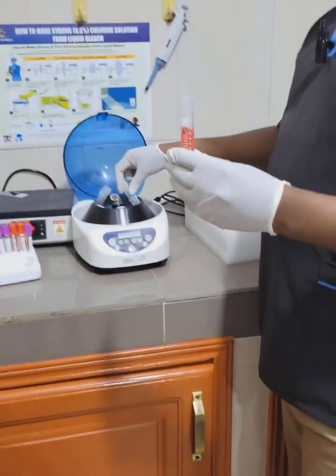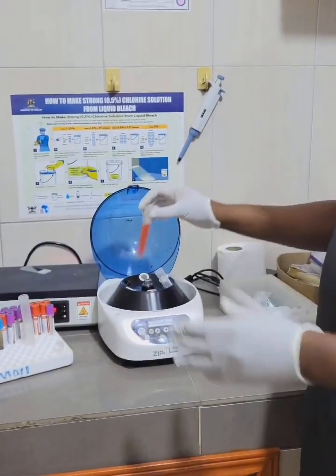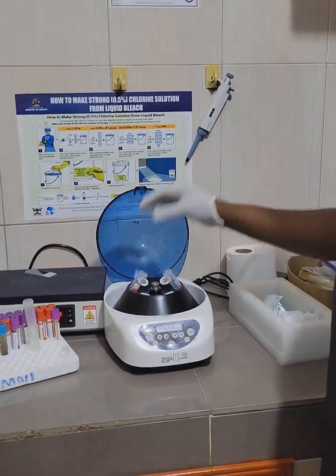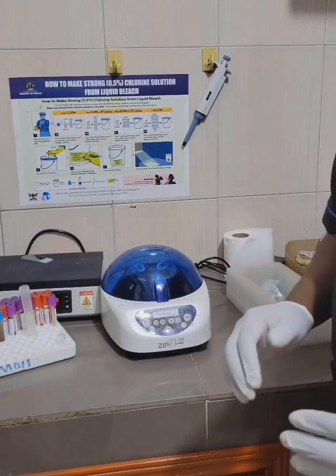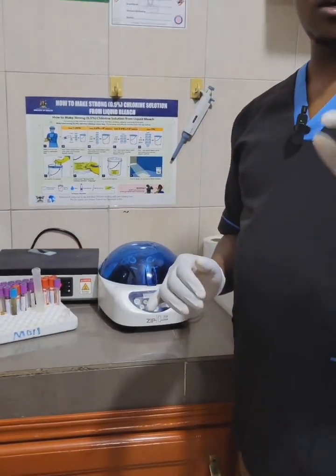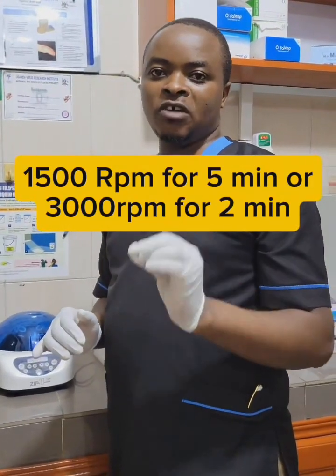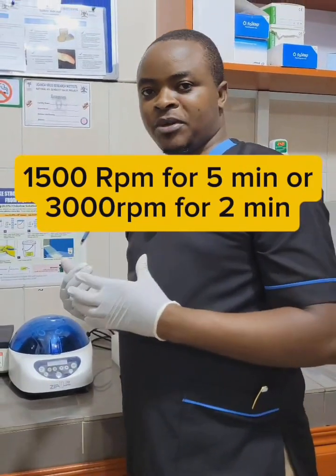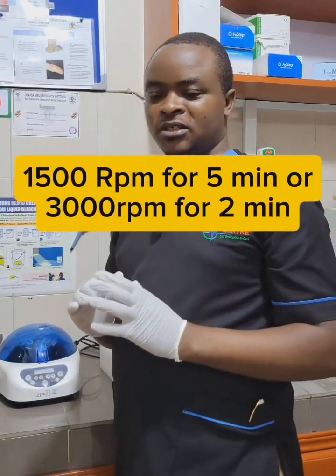You load both the urine sample together with the tube you're using for balancing into the centrifuge. Then afterwards, close the centrifuge and set the centrifugation speed. The one preferred, we can use 1500 RPM for 5 minutes, or we can use 3000 RPM for 2 minutes. So you can choose which can be easier for you.